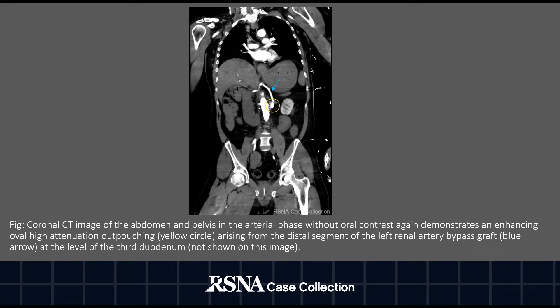The coronal CT image of the abdomen and pelvis in the arterial phase without oral contrast again demonstrates an enhancing, high attenuation, oval outpouching shown in the yellow circle. This area of high attenuation arises from the distal segment of the left renal artery bypass graft at the level of the third duodenum, although the third duodenum is not shown on this slice. The distal segment of the left renal artery bypass graft is annotated with a blue arrow.